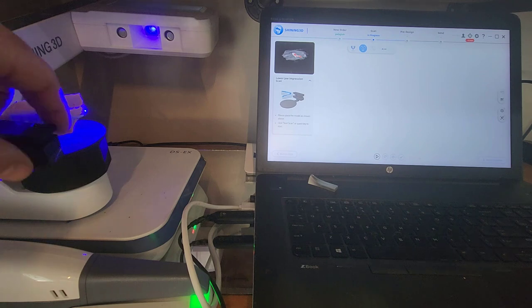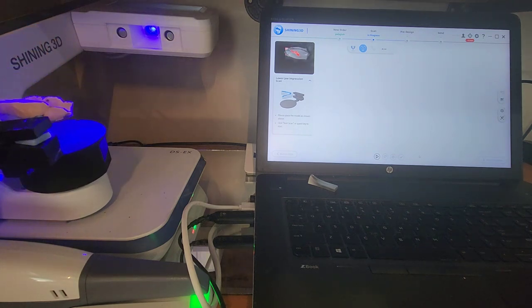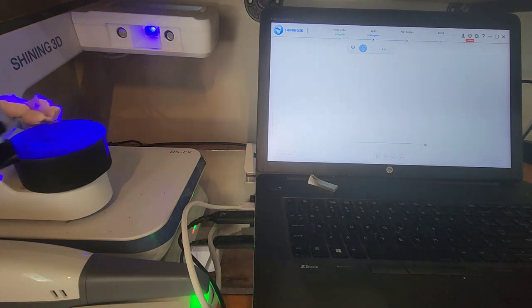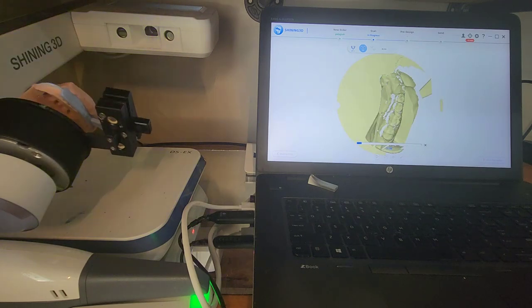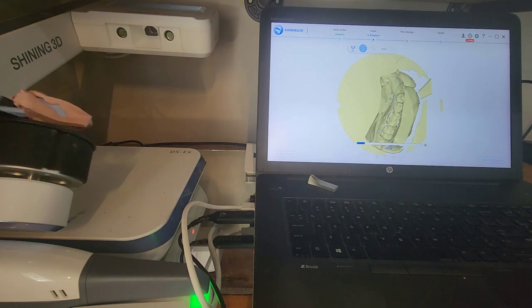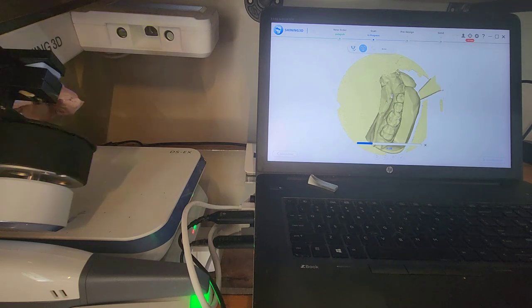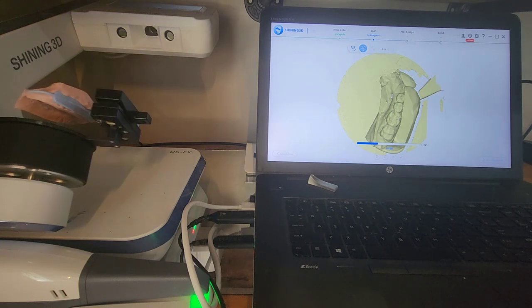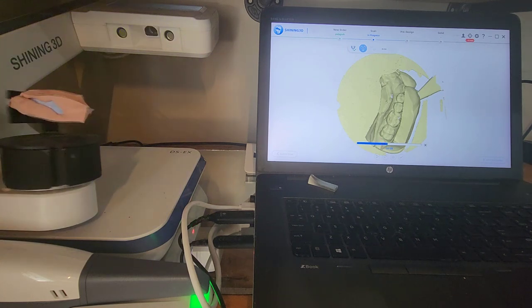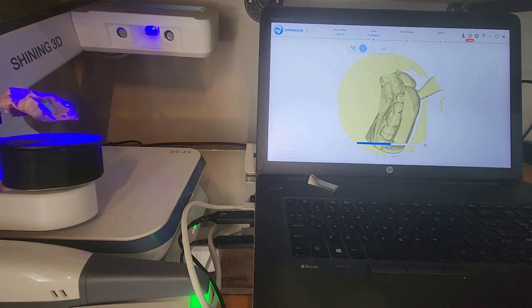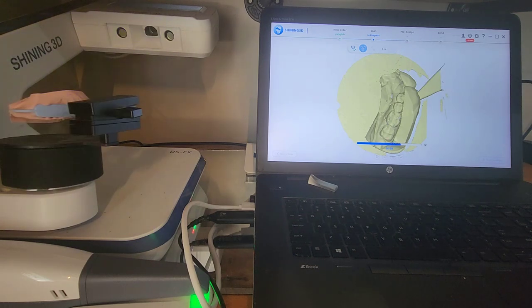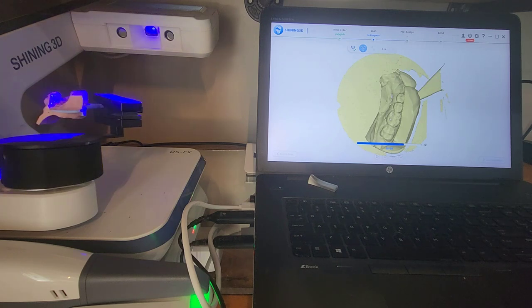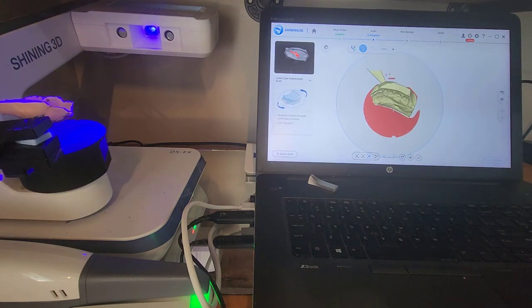Now it wants me to do the lower impressions. So you simply take this, flip it over with the magnetic clip, and now you can hit the Play button again. And so as you see, this one's taking 28 images instead of 35. And so usually it's going to spin it around from the side and take a bunch of images. Then it comes up on an angle, takes another round of images, and then it will look directly into the occlusion and pick up all the occlusal surfaces, incisal edges, and so forth. All right, so images are done. It's processing.